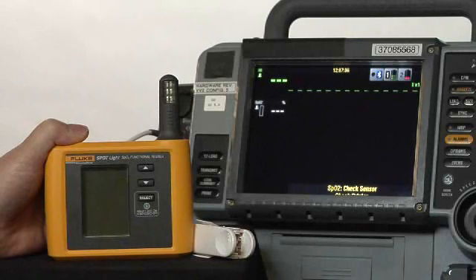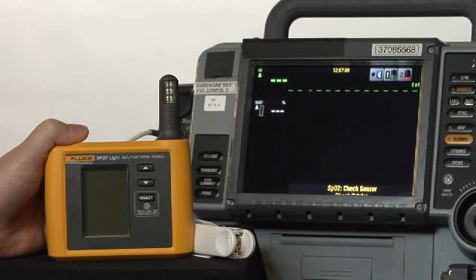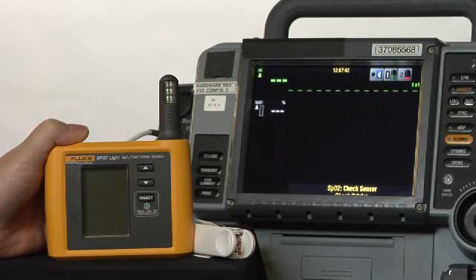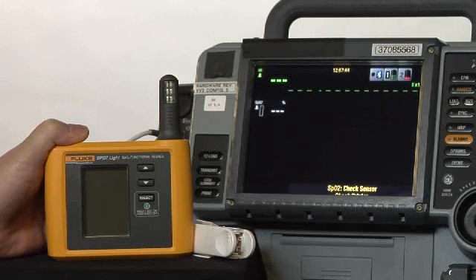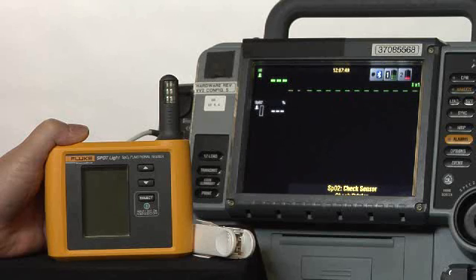We're going to talk about a scenario that a lot of us face and a lot of us just use our finger to test, and that's a trouble call from the clinical unit where they say there's something wrong with the oximeter. In this case, it's an oximeter in a defibrillator. It happens to be a Masimo.